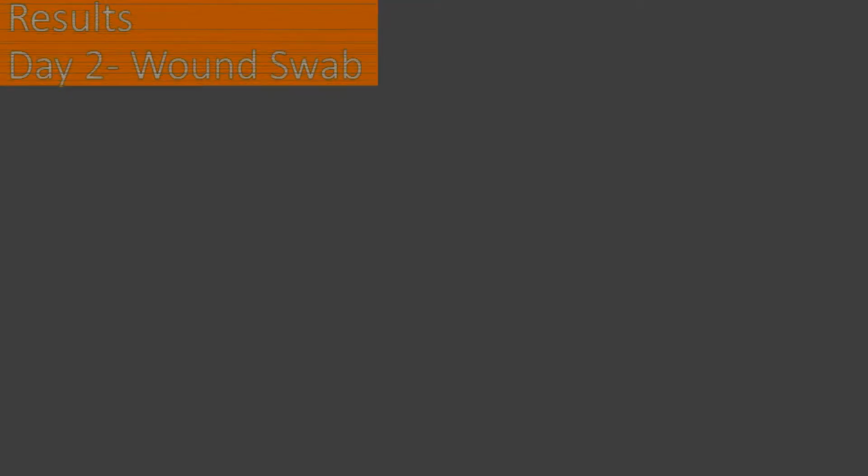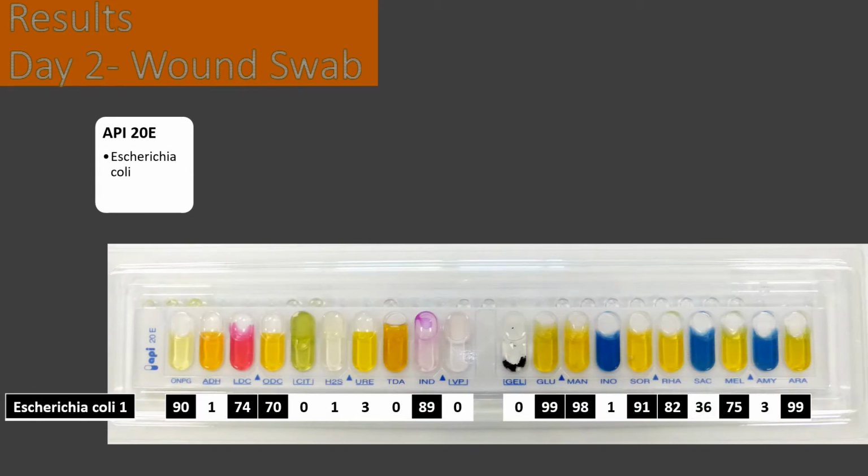After incubation, the API 20E, as we can see, is positive for ONPG, which confirms the lactose fermentation on the MAC and the fermentation of most sugars on the right.